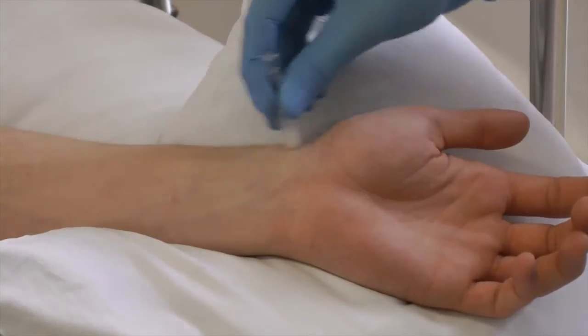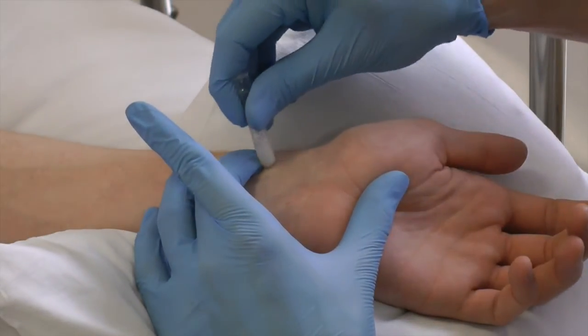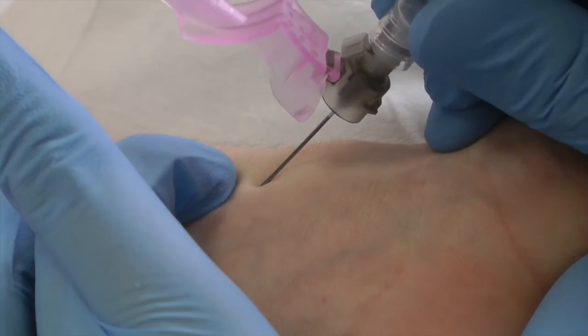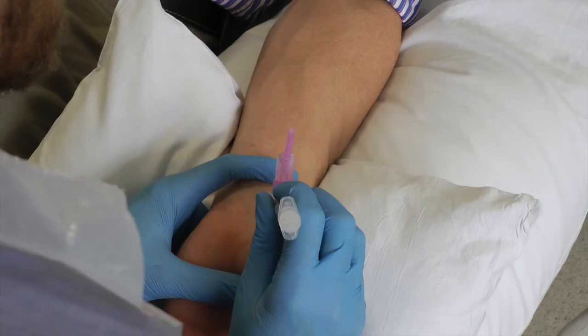Clean. Palpate and re-clean. Insert needle. Flashback — the arterial pressure will fill the syringe with blood without the need to aspirate.